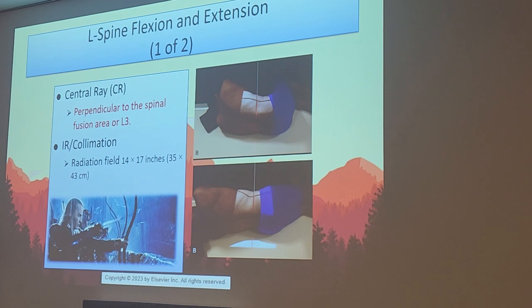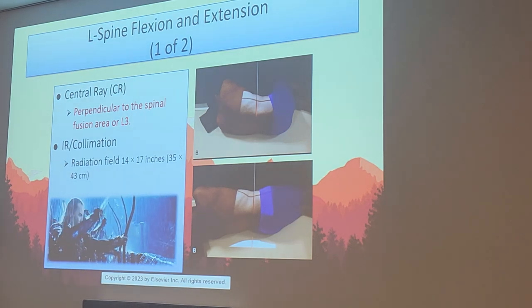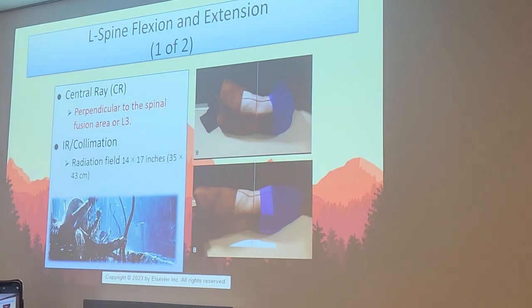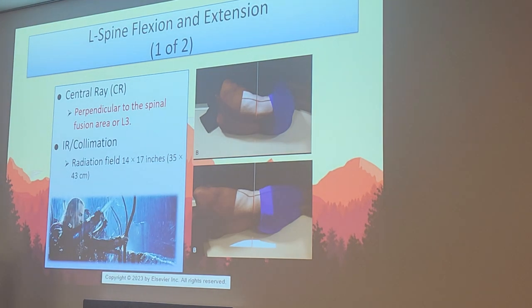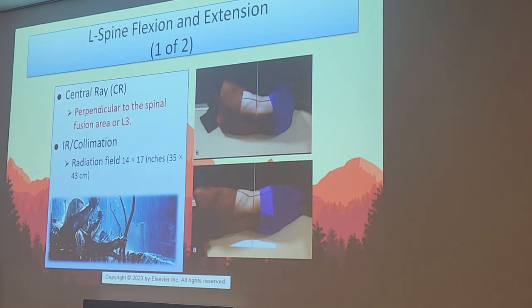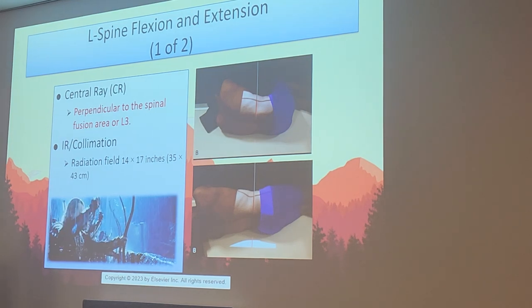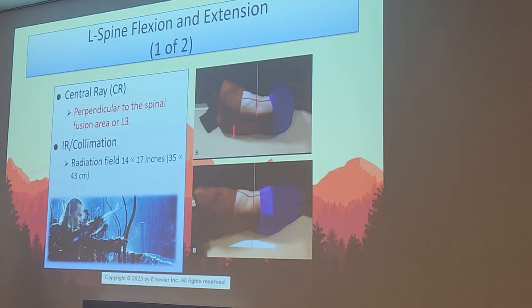All right, so once again, if there is a spinal fusion, you center at that point, but if there's no indication, you're going to use L3. So it's 1 to 1.5 inches above the crest. And you're not required to collimate on this one. Leave it open, to accommodate for the flexion and extension of the body. This is how I would do it, guys, preferably.